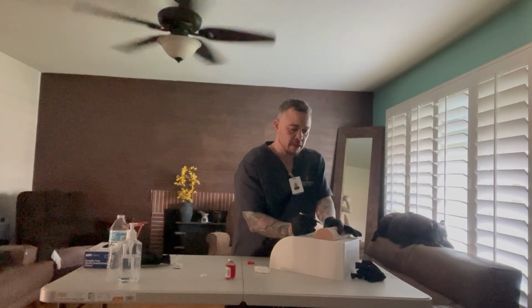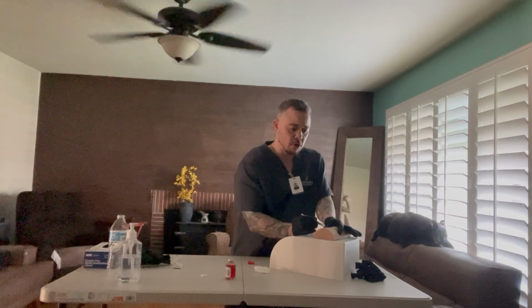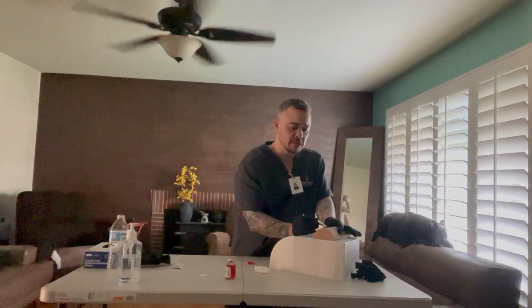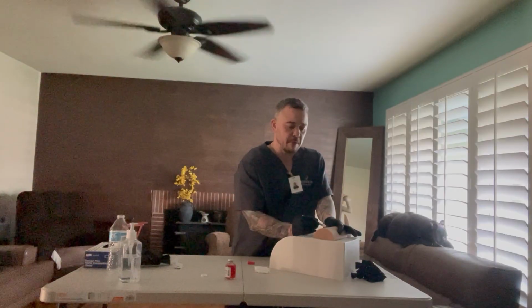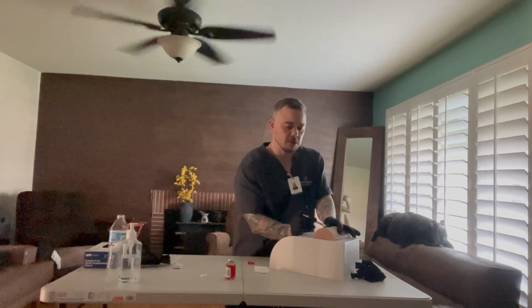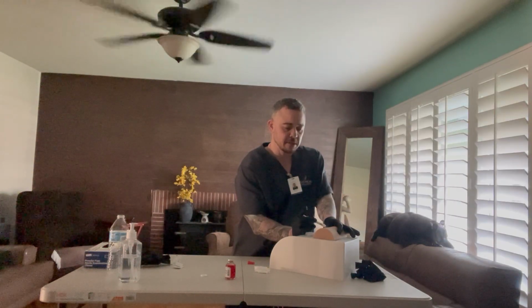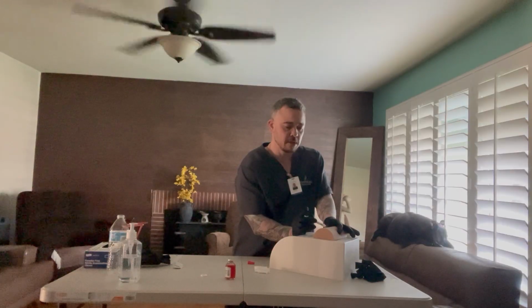When I go in, I'm going to go in slowly, but I'm only going to go in about 3 millimeters, and if I feel pressure, it means I went in too far. Then I'm going to inject the medication slowly.